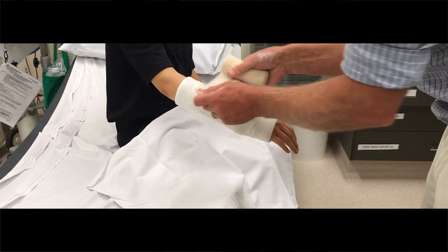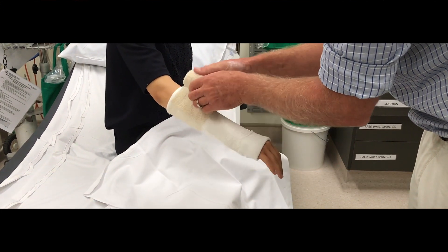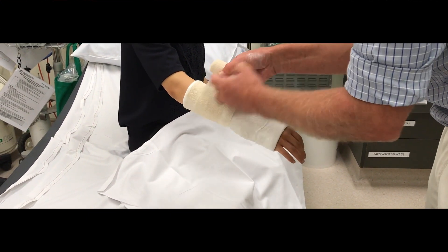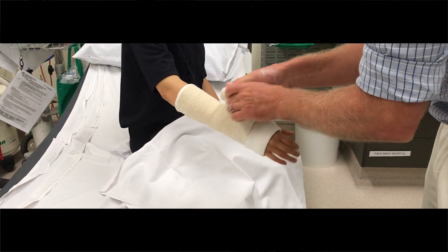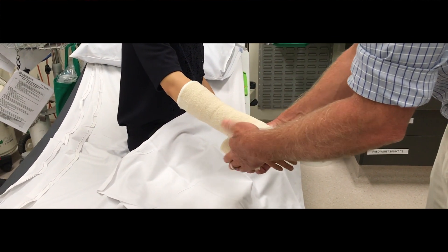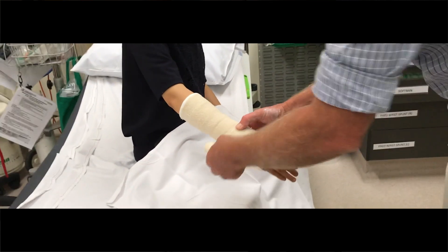It does surprisingly feel nice and warm. Yeah, and it'll get hotter and hotter. So I'm going to just go up to the edge there. Make it look as neat as you can, and quite firm — you don't want it to be loose on them. So pull it quite firm and run that down. And when you get to the thumb, just give it a twist through there and one bit back around.